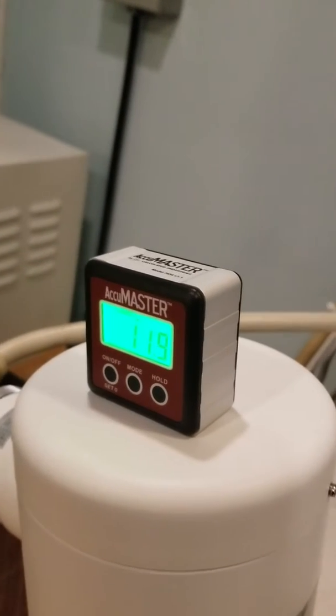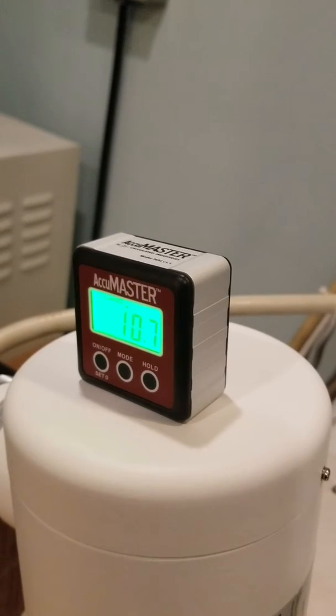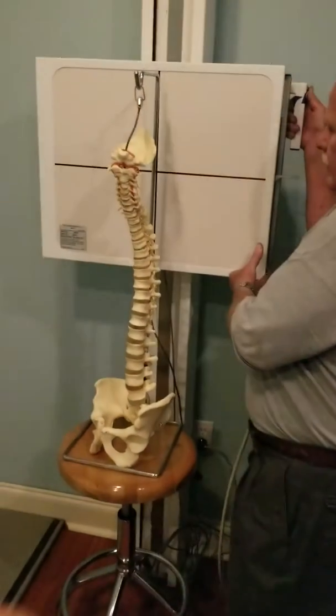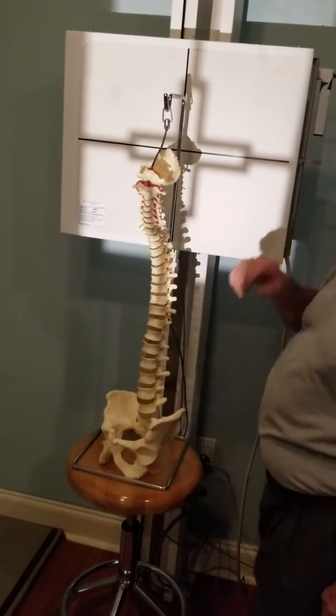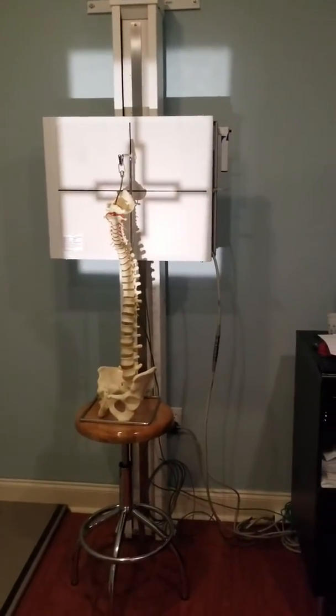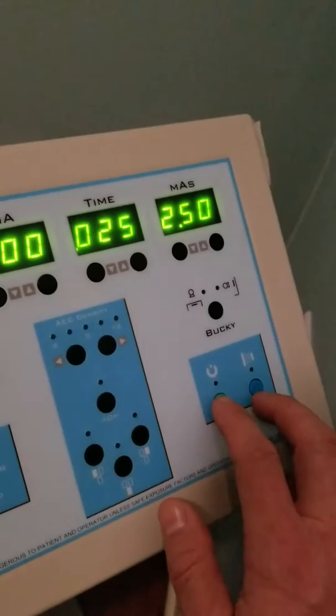And we want to get that as close as possible, but we won't be able to get it quite perfect, but within a half a degree. And then we've got to now raise the grid cabinet up to where the crosshairs match up with the line on the grid cabinet. And now it's ready for the first exposure. You'll have the patient open their mouth wide, just like we always do with the AP open mouth. You come behind the control panel here. There's no longer any need to use this mouse for anything. So instead, we're going to just do the prep and the expose.